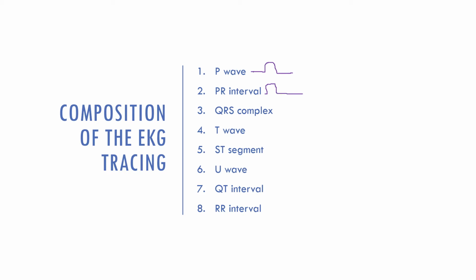So this is your PR interval. So the P wave is just this. Your PR interval is all of this.